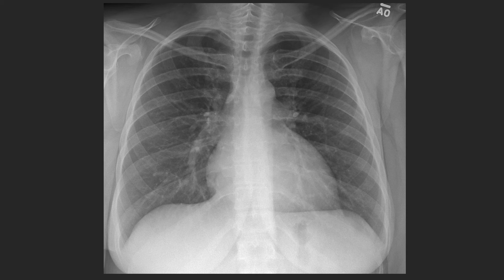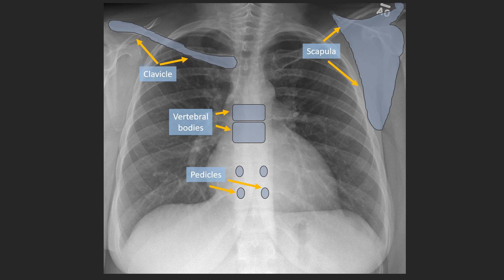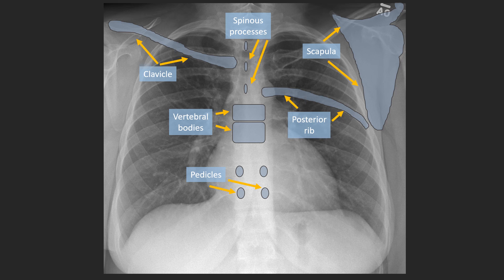Moving on to bones and soft tissues: the clavicle extends from the midline laterally and connects to the scapula via the acromion process. In the midline, the rectangular vertebral bodies are visible, and arising from them posteriorly are the pedicles, which appear circular because we are looking at them on end. The spinous processes are the most posterior aspects of the vertebral bodies and appear ovoid because they are elongated structures seen on end. The ribs have a posterior portion that contacts the vertebral body and swing anteriorly; the very anterior aspects of the ribs are not seen because they are cartilaginous.